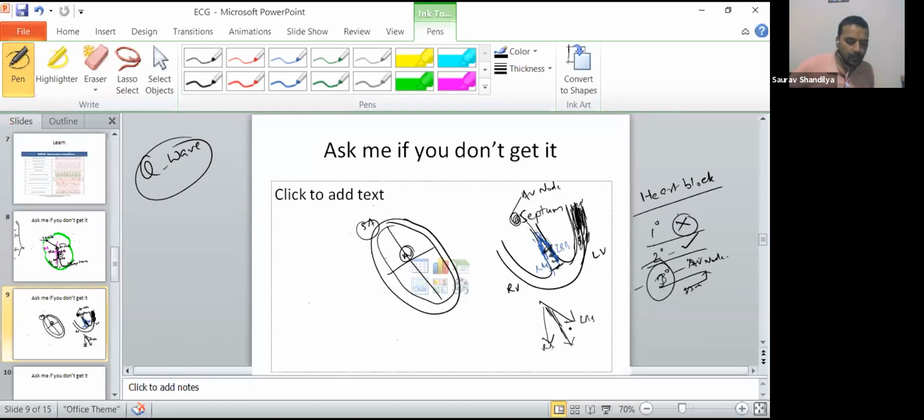Now this resultant vector, all the time, because it is not the story of one time, is getting suppressed by the left bundle branch impulses toward the right branch. I mean, it has to cross the septum, as I told you. So it gets suppressed, right? So when it is a recording, it is positive, as I told you, please believe me, for some time, negative to positive. So when the resultant one is going away from the positive, it will show the negative deflection. So the Q wave is negative because of that. If you have any question, please ask me.